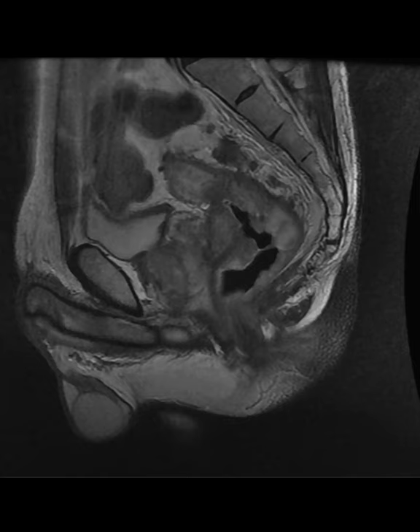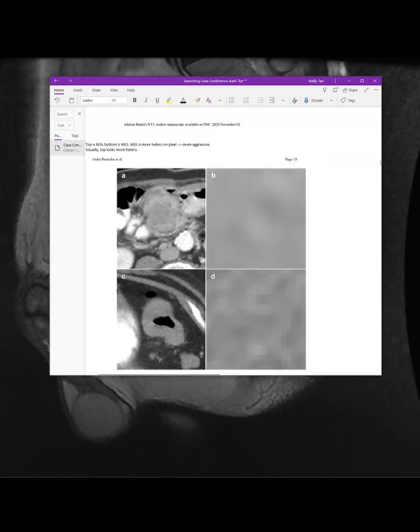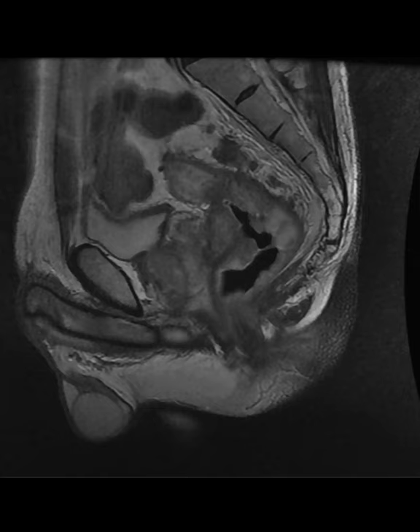What I thought was kind of interesting was there's this paper in Abdominal Radiology where they looked at the radiogenomic features. So the top one was MSI, microsatellite instable. The bottom feature is stable. Again, this is more aggressive. And when they zoomed into the pixelation, it's more heterogeneous. And that was one of the things that they said was differentiating from MSS. So the microsatellite stable ones are more heterogeneous when you see the pixelation compared to MSI. I guess that makes sense. We often think about heterogeneous things being a little bit not a good thing compared to more homogeneous findings.